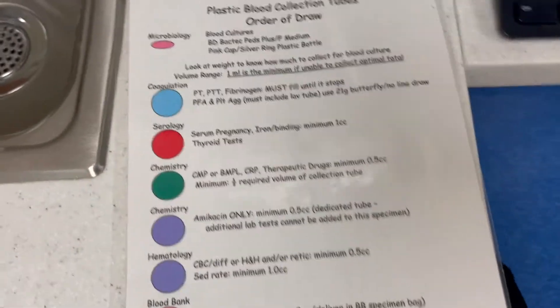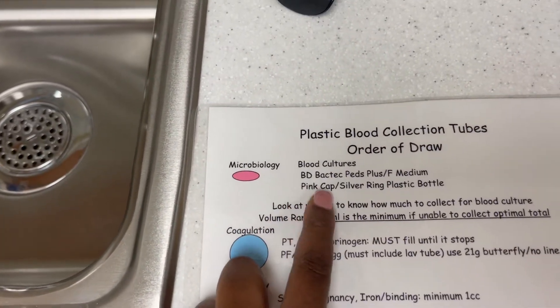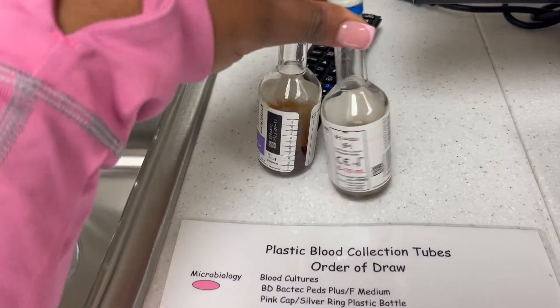So right here we have an order to draw. First, it's always going to be blood culture bottles. This is the set I'm talking about right here — this is going to be first.